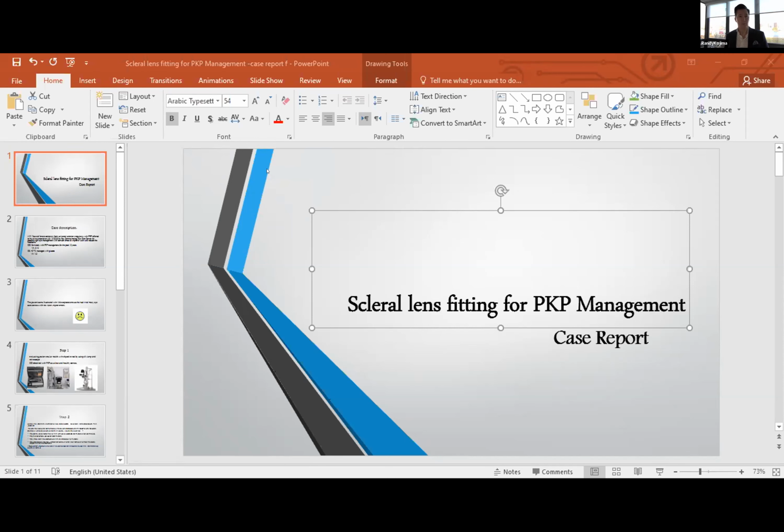Ricardo, what is your experience with Smartlens, and what material are you using most with it? And has that lens been performing well in terms of scratch resistance and wettability and such? Yeah, the most common material is either the Extra or the XO.